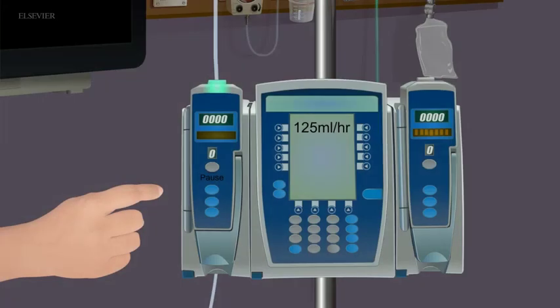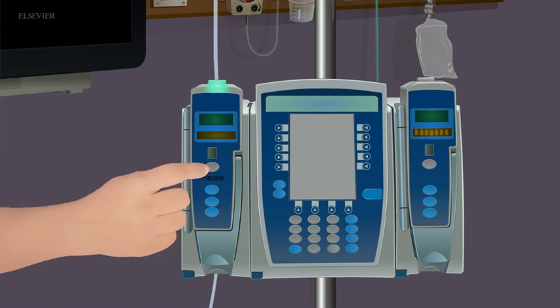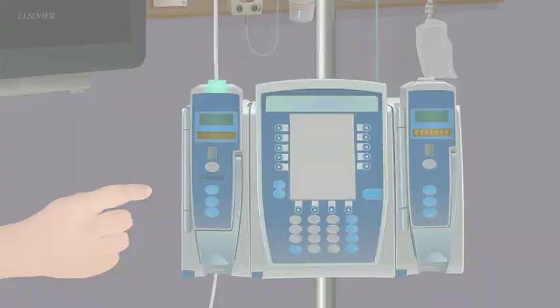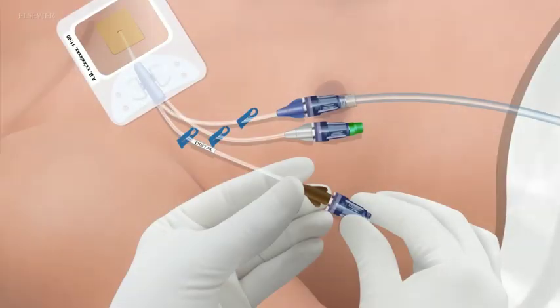Central venous access device method. If appropriate, stop all medications and IV solutions infusing through the central venous access device, CVAD, and flush per the organization's practice. Select the appropriate lumen for blood sampling and clamp the port.